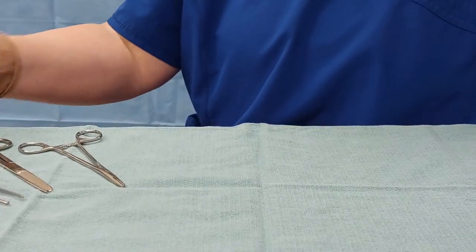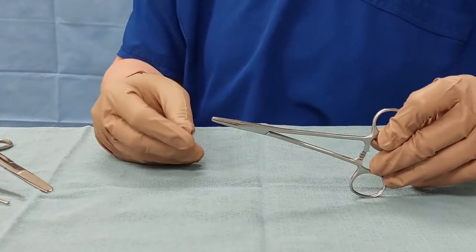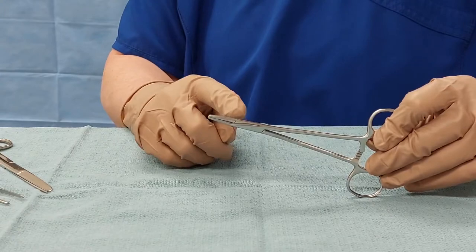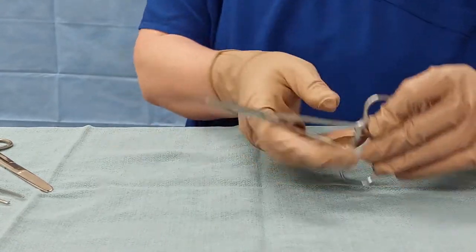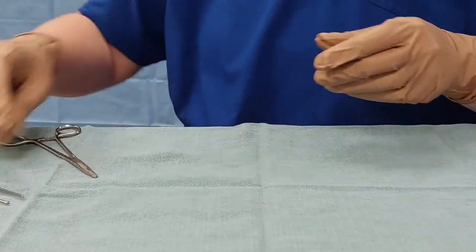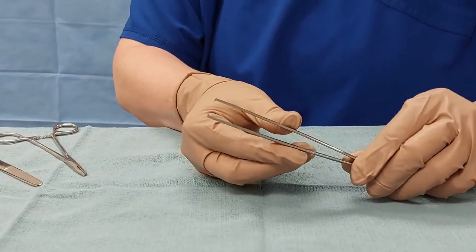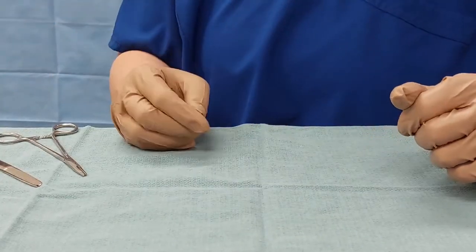This is an Artline training video for suturing. We're going to start by talking about equipment. First of all, you'll need needle drivers. Either straight tip or curved are fine, whatever is your personal preference. You will need a pair of scissors and a pair of forceps. Not everybody uses them but they're handy to have, so keep them with you.